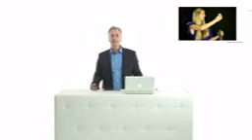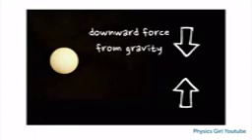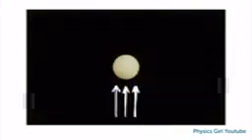And there's another finding, but we'll talk about that finding later. First, I want to explain why this jet is severe, even though it doesn't look as if it's severe. Look at this video and see what happens. Now, this ping pong ball is put into the stream of air generated by a vacuum cleaner. And you see that the ping pong ball doesn't fall down, but that it moves with the stream of air.